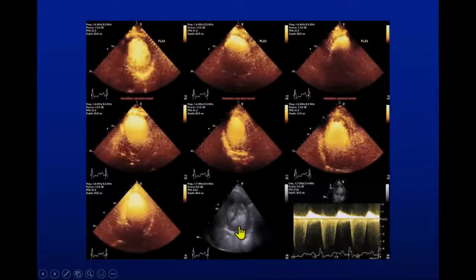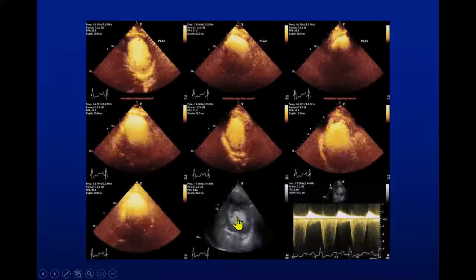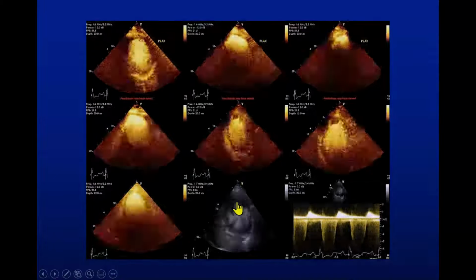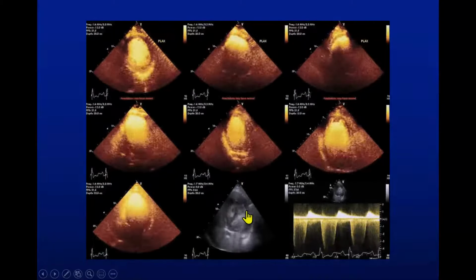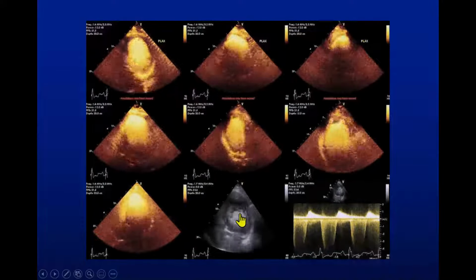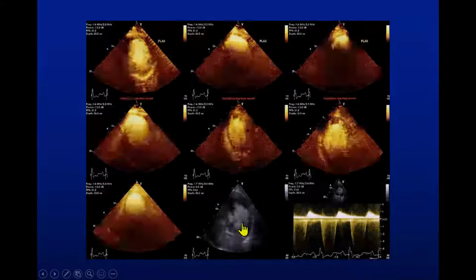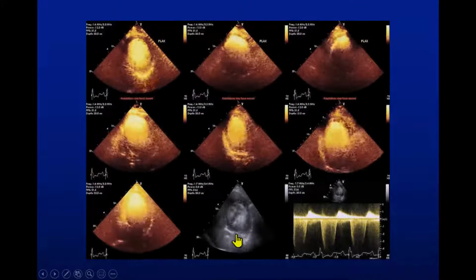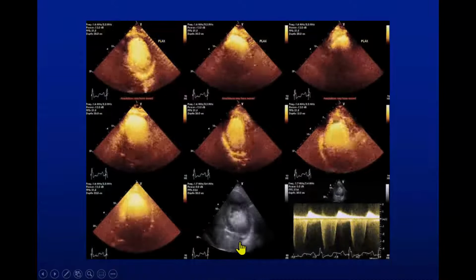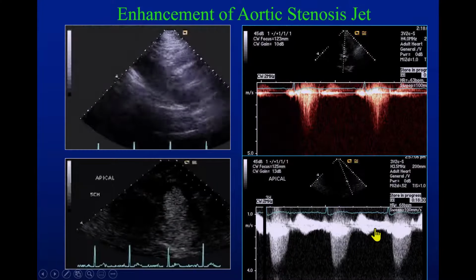This is a high mechanical index image, where you're destroying quite a few of these microbubbles. You see this hurricane-like appearance, and much of the destruction is very close to the transducer itself. Once you see this, you know that you're dealing with a high mechanical index or very low contrast coming in. However, here I can differentiate it because my input function is still pretty good. I see a lot of contrast coming in. Most likely that's a high mechanical index situation.